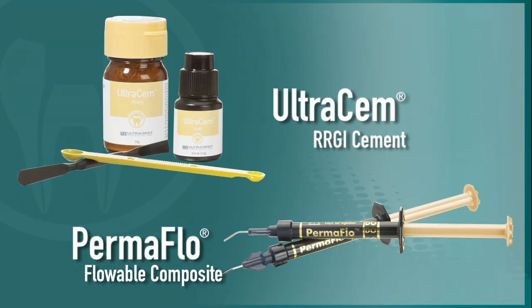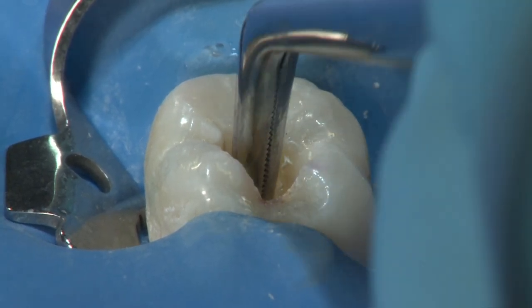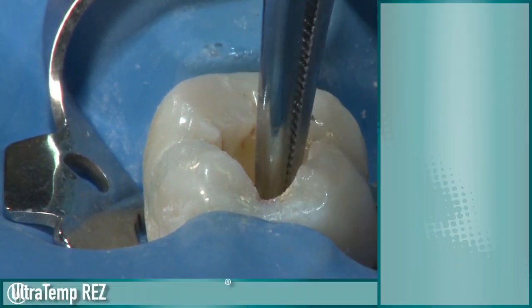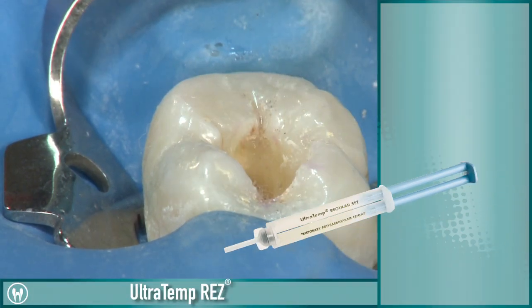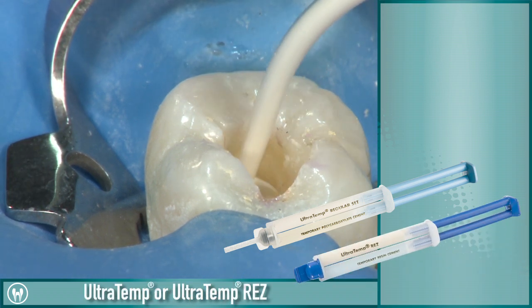Additional flowable or resin-modified glass ionomer may be placed. Temporization of the coronal aspect of the tooth can then be achieved by placing cotton pellets and closing with a firm temporary cement, such as Ultratemp polycarboxylate temporary cement or Ultratemp Res.